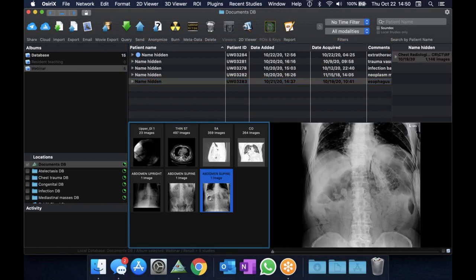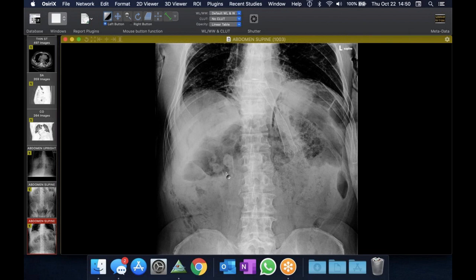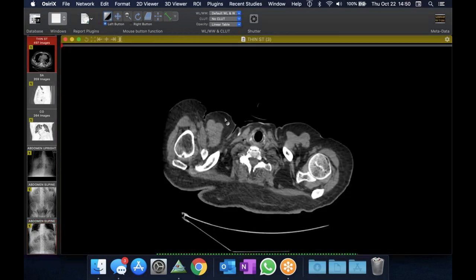Okay. This was somewhat of an interesting case. So this patient has esophageal cancer and had a stent placed for palliation of that narrowing near the esophagogastric junction. And you'll notice the stent orientation is kind of odd, and there's some funny gas in the upper abdomen, and we see some gas down here as well. It was apparently a very difficult procedure, and they were concerned about a complication. So here is the post-procedural CT.